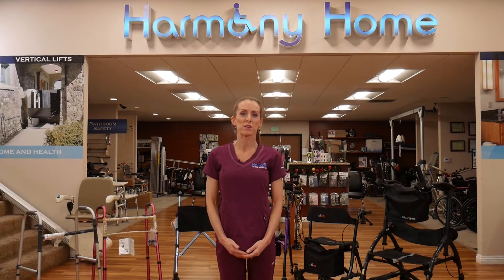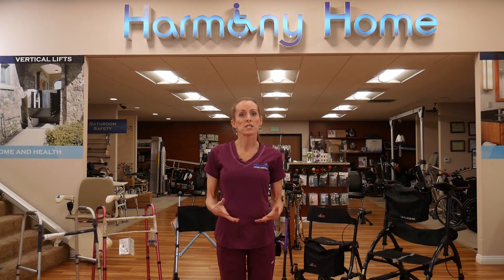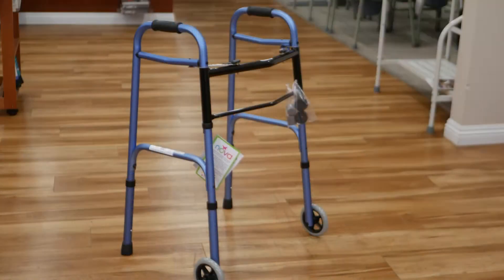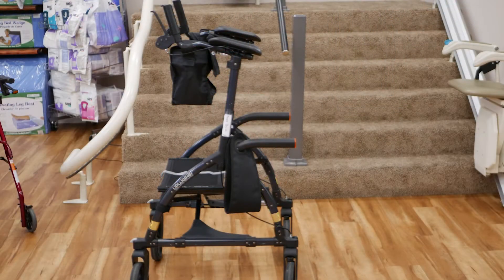Hi, I'm Erica with Harmony Home Medical, and like Harmony Home Medical, I'm here to help. Today I wanted to talk about walker choices in the market. There are several different walkers available for people to use, and sometimes it can be confusing to know which one is the best option.